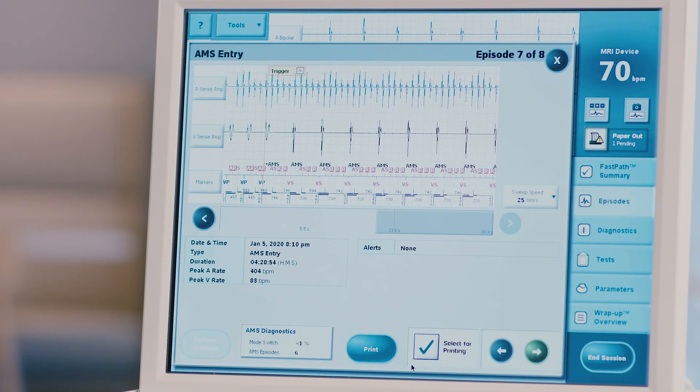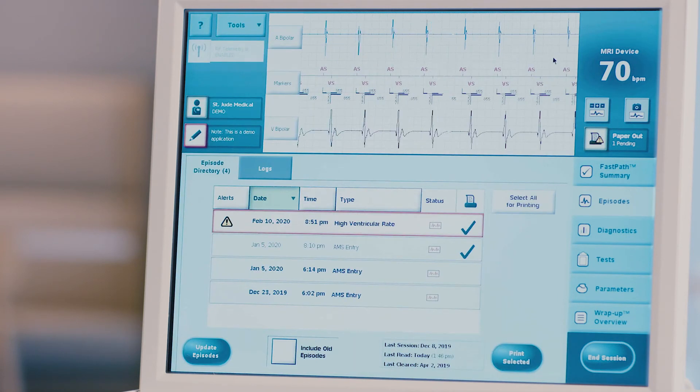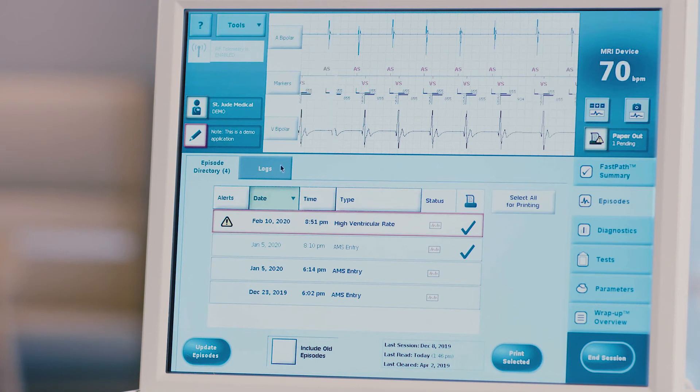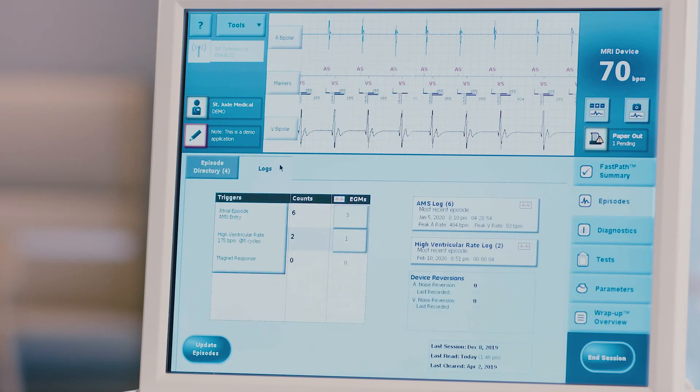Note that certain episodes will be pre-selected for printing. Press X to close the screen. Repeat these steps for all relevant episodes listed. Choose the logs tab at the top of the screen to review the total counts for each episode trigger type.